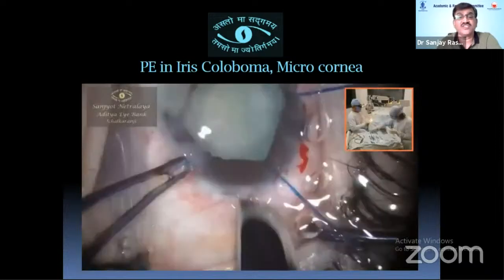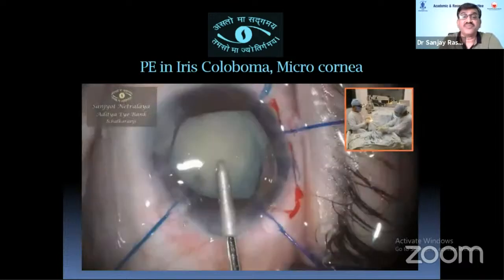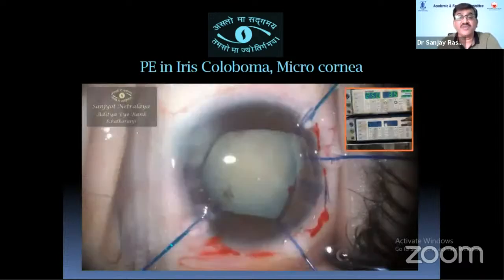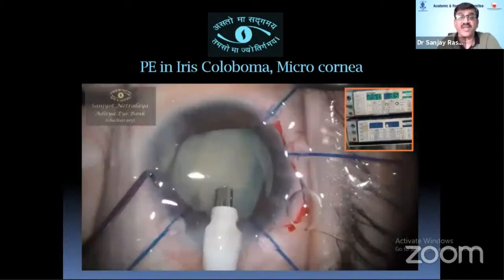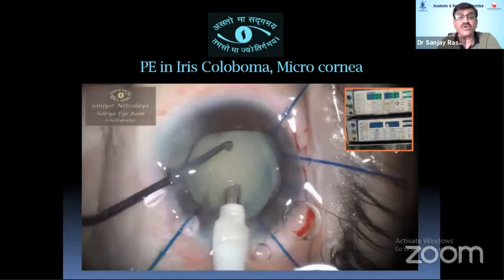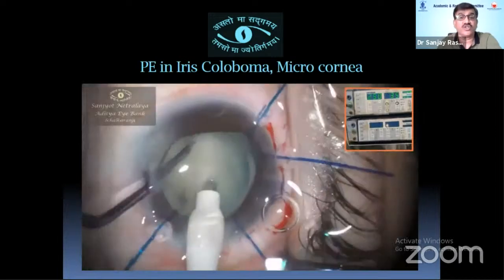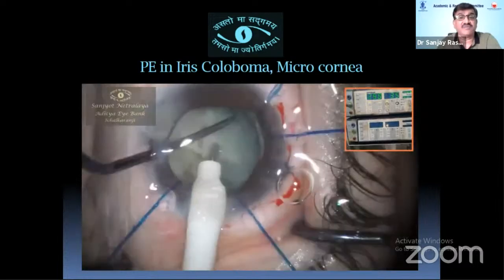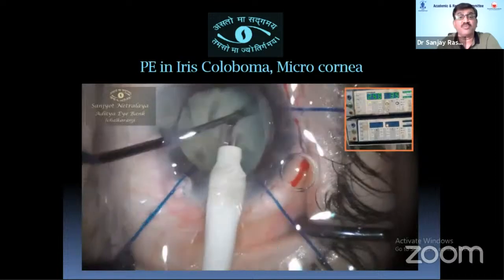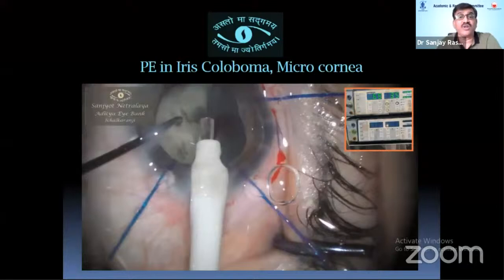The tunnel is created. The superficial cortex is aspirated for better visibility and estimation of the size and hardness of the nucleus, to set the optimum phaco power on the panel. The center of the nucleus is buried with the phaco tip, and the nucleus is divided into 2 pieces with the horizontal chop technique. Here I always try to sub-chop the right half of the nucleus into multiple small pieces with a single hold to save phaco energy, and all small pieces are emulsified immediately.